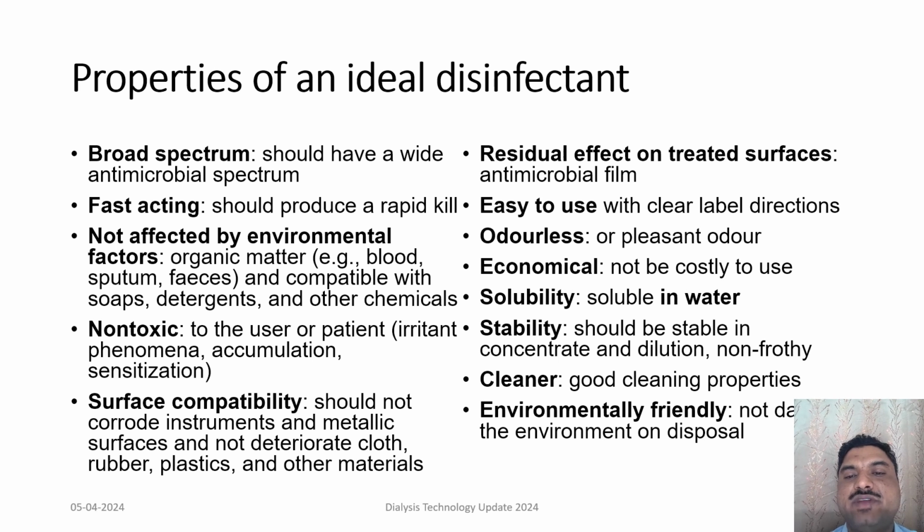These ideal disinfectants should have a residual action when treated on a surface by forming a thin film. Also, they should be easy to use, with clear labels of directions. They should be odorless, and should be economical, because cost is something which has to be kept in mind while using disinfectants. They should be soluble in water and should be stable in various dilutions and concentrations, should not be frothy so that they can be cleaned easily, and they should have very good cleaning properties also. And the most important part is they should be environmentally friendly.